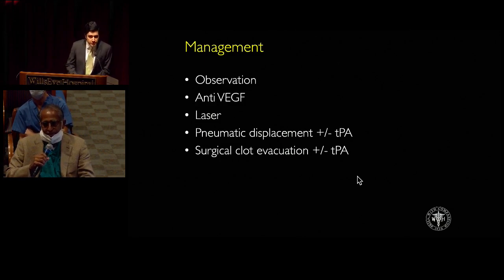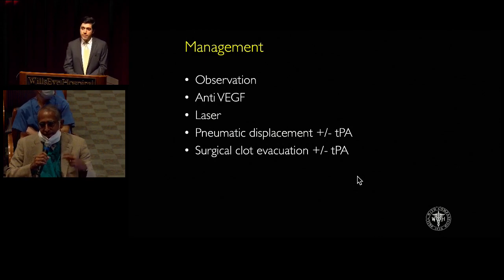And what type of laser would you use? Argon? Yeah, argon green, 200, 200, 200, and you can just usually surround it rather than treating it directly. And you have to give one or two treatments. It needs several months for it to totally resolve.